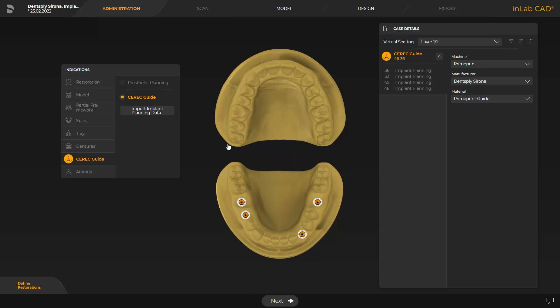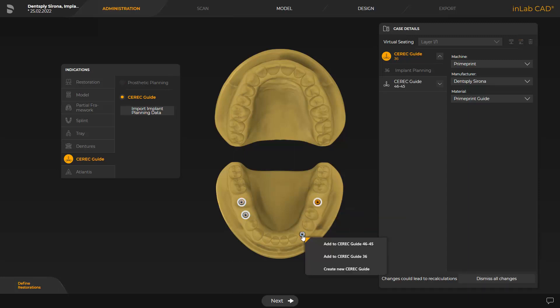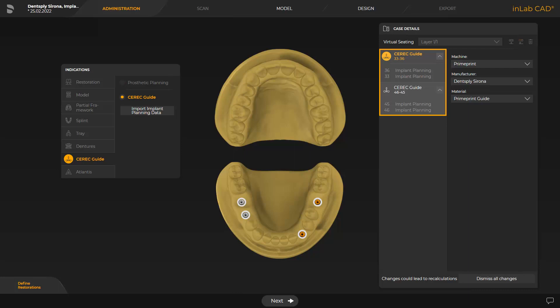This proposal can be adjusted for the implant positions with left and right clicks. For demonstration purposes, we modify the initial proposal and plan one guide for each quadrant. With a right click, the implant positions can be deleted from the current guide. With a left click, a new CEREC guide can be created for the selected implant position, or the implant position can be added to a different guide. Now, two guides that can be designed separately are displayed under Case Details. We now proceed with our original case.